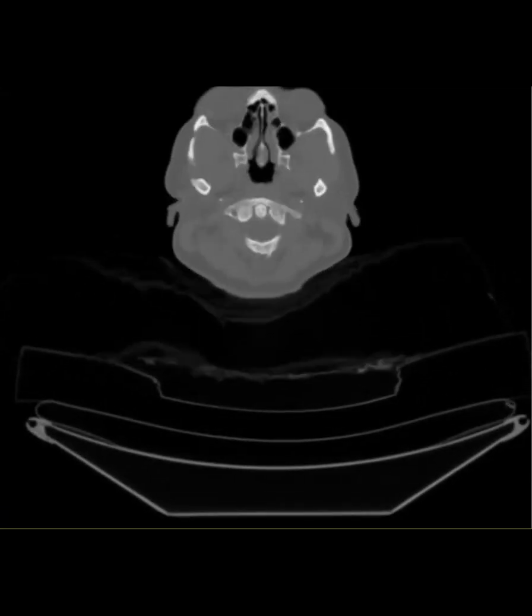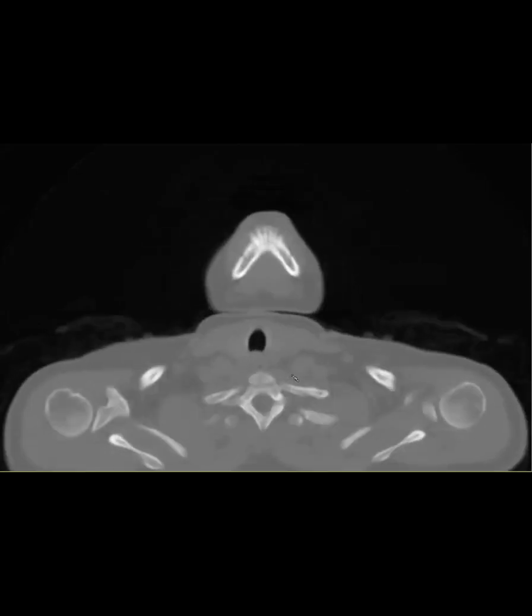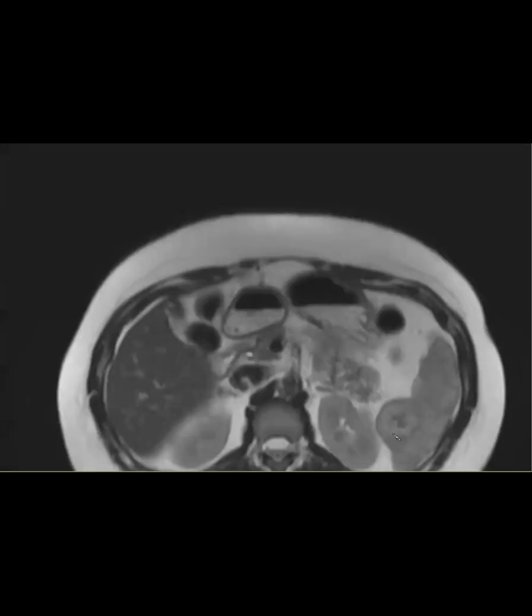So one take-home point is that you can biopsy the spleen, and we've done that before. But this is the PET scan, and you can see that they've got these lesions in their skull, in their calvarium, that are a little unusual looking. I kind of forgot about this entity because I think people see it more in neuro, but the patient ended up having an entity where they get calvarial lytic lesions, and they can even sometimes get orbital lesions. So anyone closer to residency have a clue about what could be causing these calvarial lesions as well as these splenic masses?